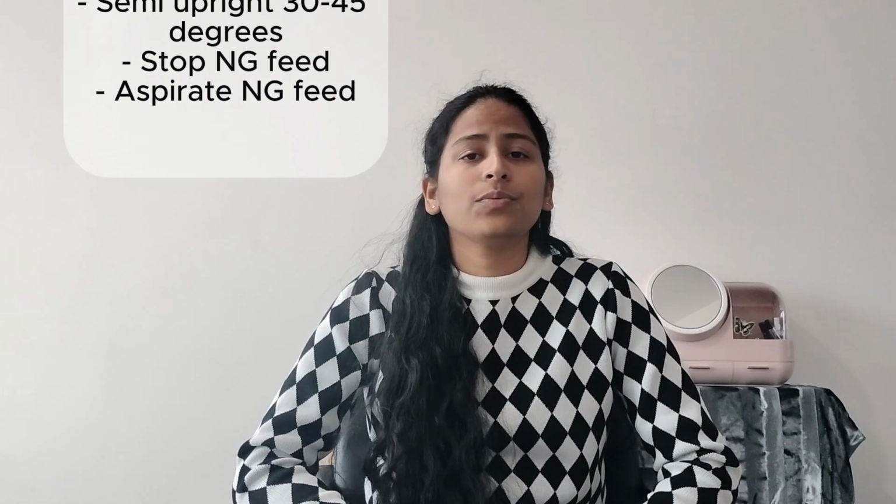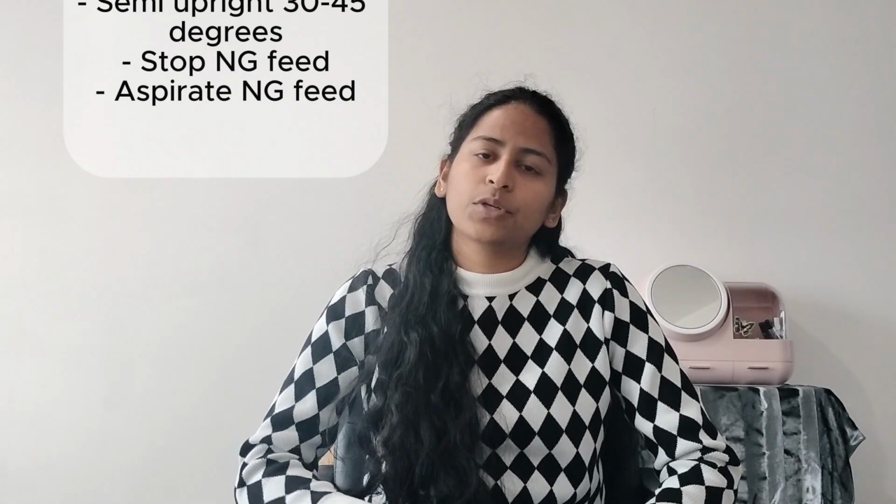Just before extubation, you would want to aspirate the NG tube as well, which would take away any gastric contents, also take away the gastric acid which has been accumulated. You do this because once you're trying to extubate, it elicits a gag reflex again, and there's high chances that they would aspirate or vomit any contents, and this can again lead to aspiration pneumonia. So to prevent that, we do this. The other thing would be to suction your ET tube before extubation.